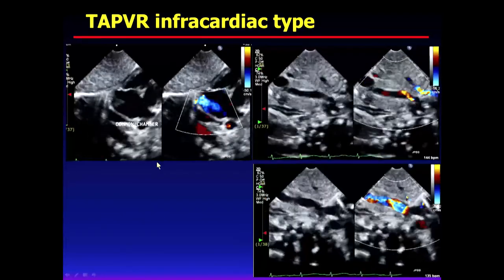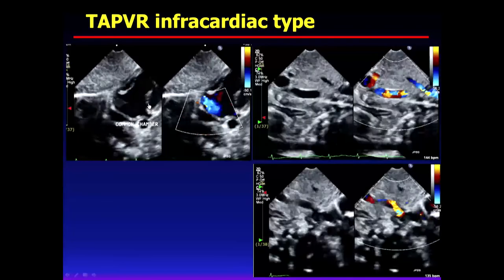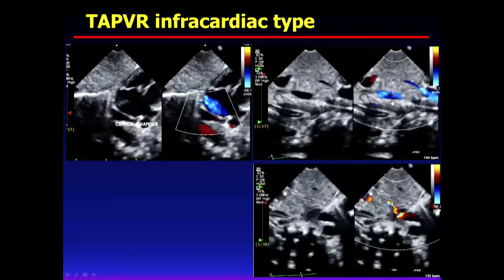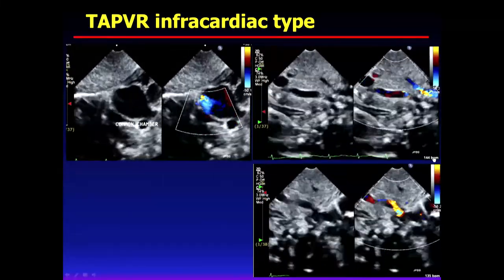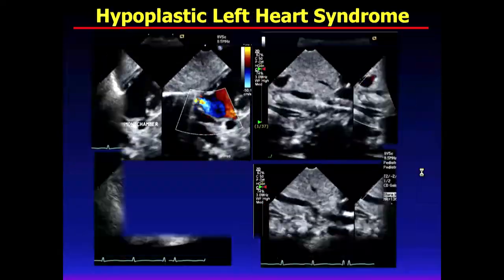And then this time, infracardiac type. Here we can notice the liver, and the heart is here. And then all kinds of venous flow having a high velocity is a problem, because it means compression or some stenosis inside there. So this is a very, very fatal emergent case.